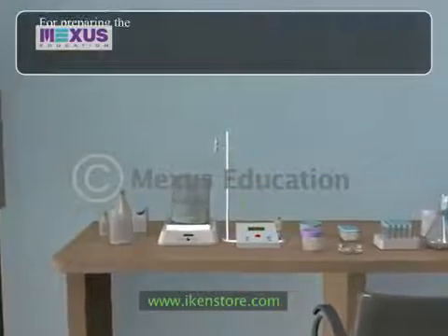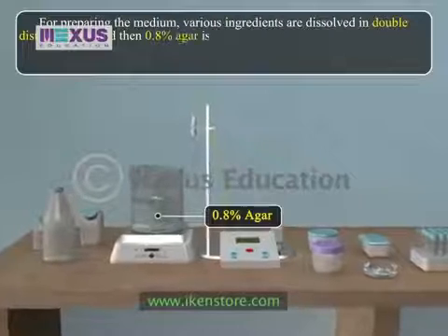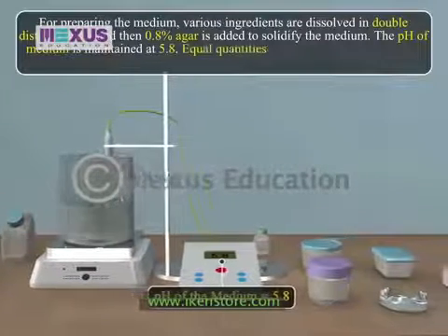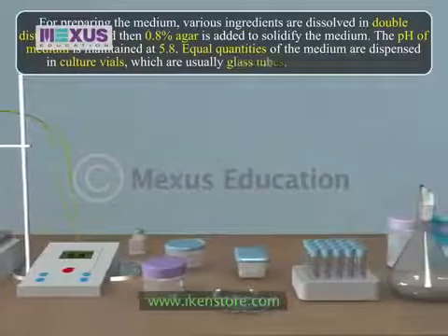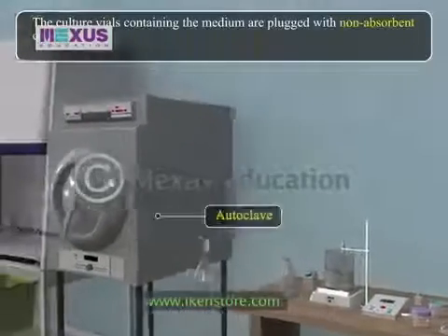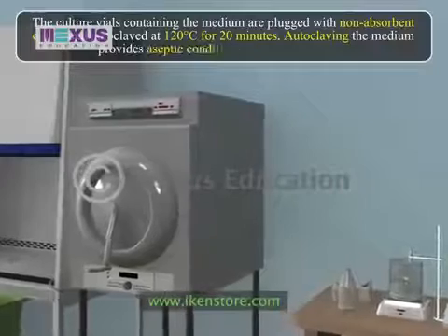For preparing the medium, various ingredients are dissolved in double distilled water and then 0.8% agar is added to solidify the medium. The pH of the medium is maintained at 5.8. Equal quantities of the medium are dispensed in culture vials, which are usually glass tubes, Petri plates or flasks. The culture vials are plugged with non-absorbent cotton and autoclaved at 120 degrees Celsius for 20 minutes. Autoclaving the medium provides aseptic conditions within the container.